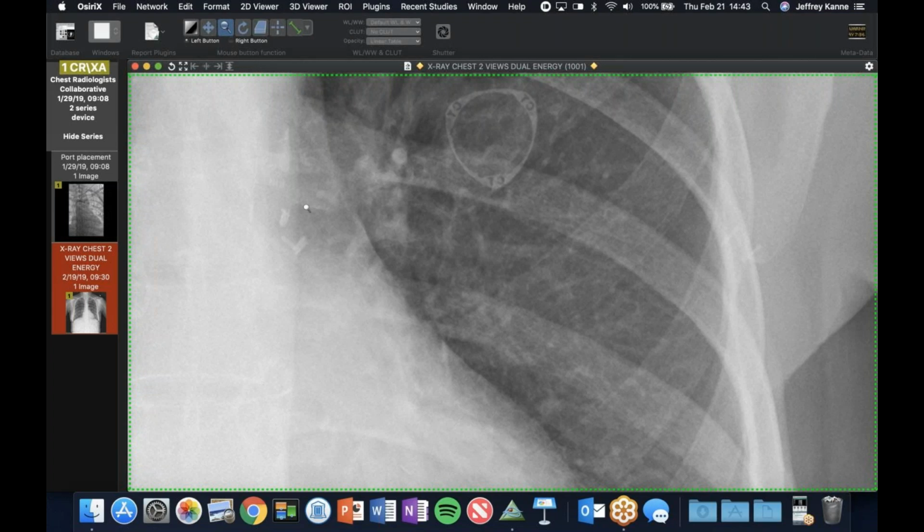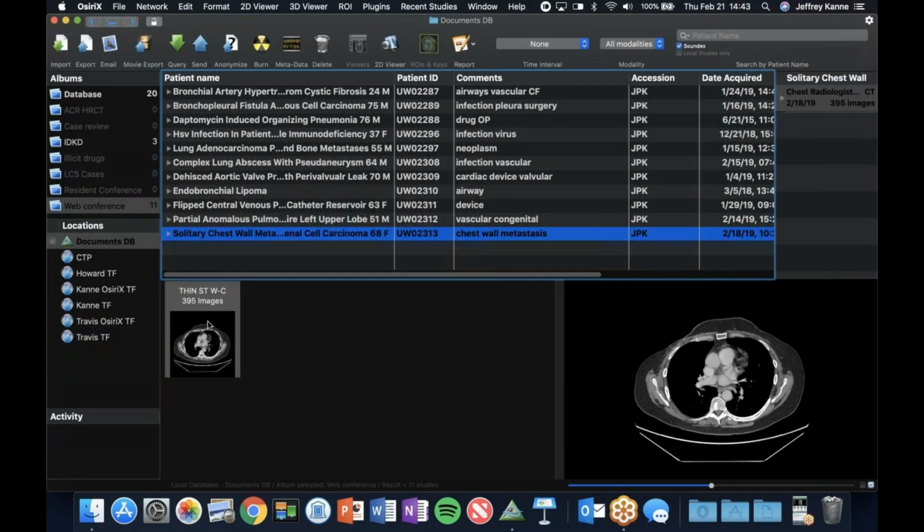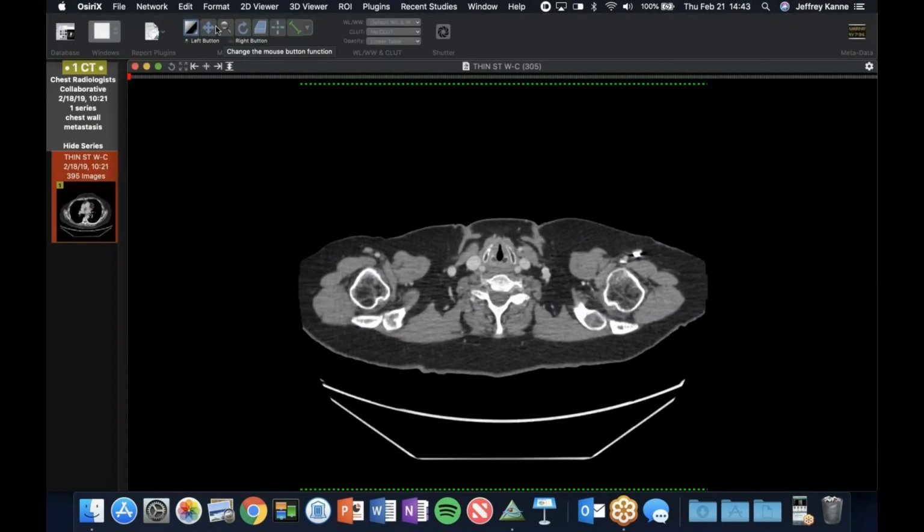And now you've come up with another case. That's wonderful. Well, it was great because I knew what to look for, because I've seen disconnected ports, migrated catheters, things like that. But we know exactly what to look for. So David, we had one too, within the last year, and I credit you for pointing that out because I didn't know what to look for either. So I thank John Harley. He's the grandfather of all of us in this.